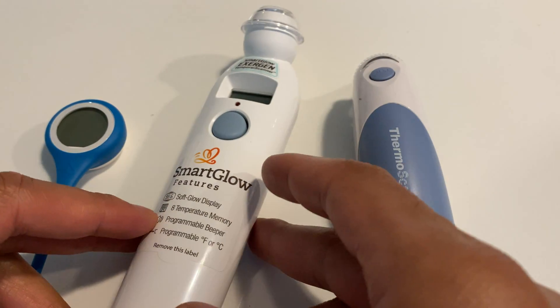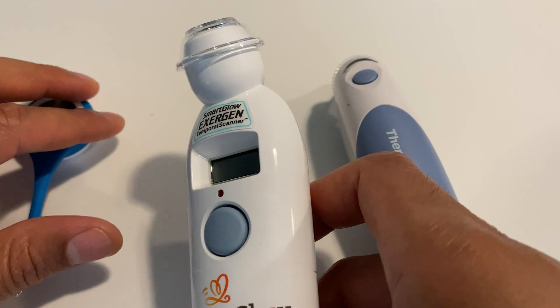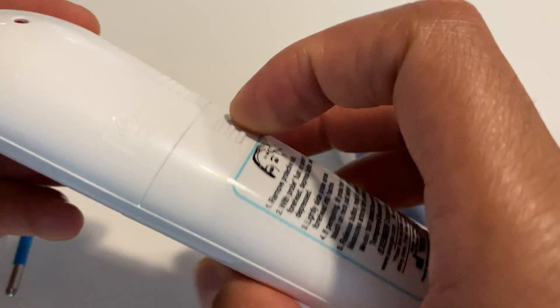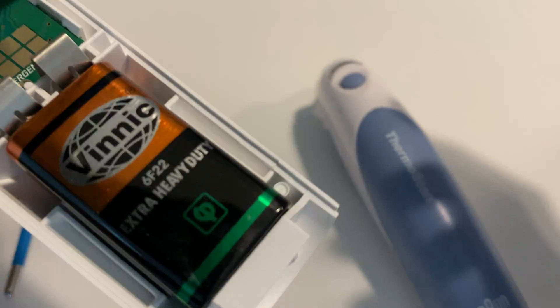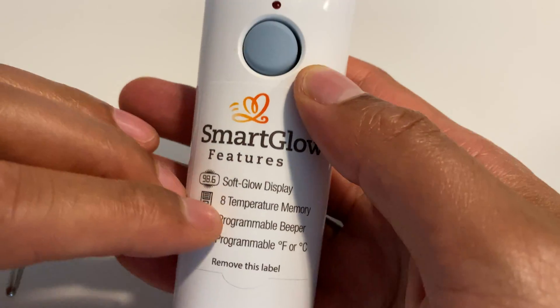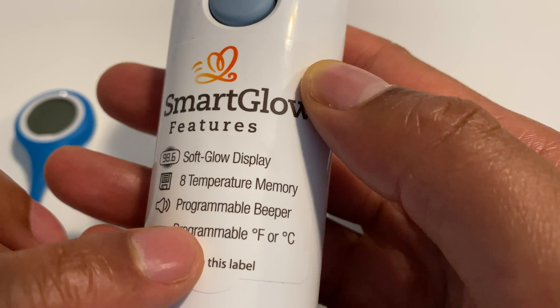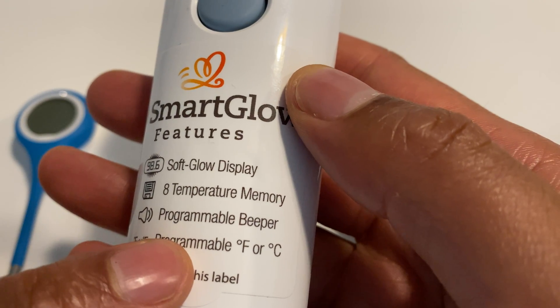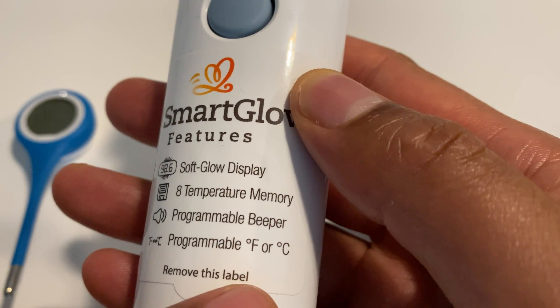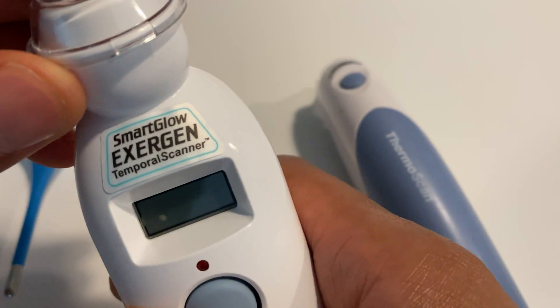The next one is the Exergen SmartGlow Temporal Scanner. This one is also popular because of the way that it scans. It takes a 9-volt battery and it really holds up the test. It has Smart Glow display, 8 temperature memory — so you can memorize what the temperature was without writing it down — and a programmable beeper. You can also program it for Fahrenheit or Celsius. This right here is a temporal scanner.